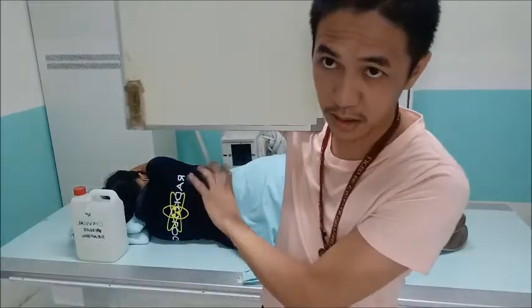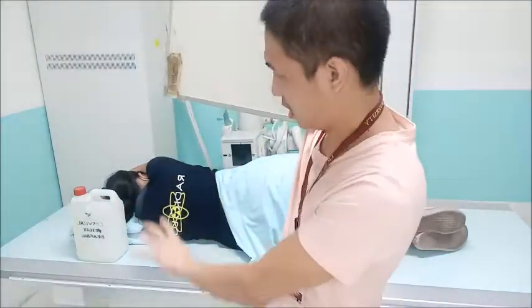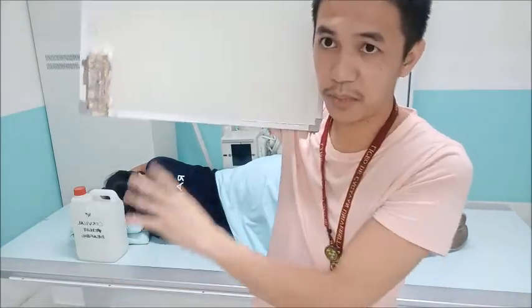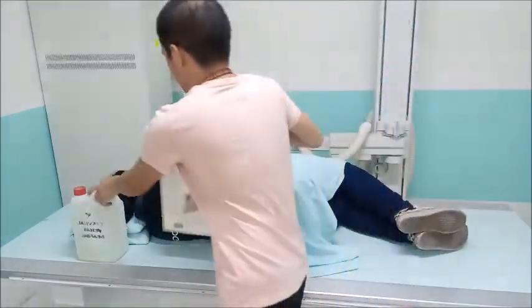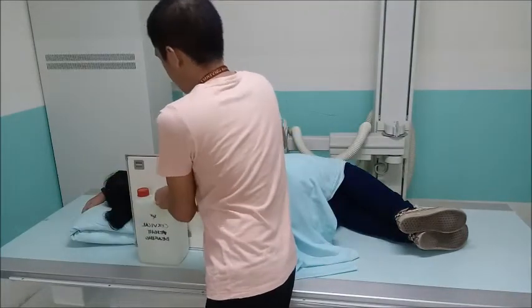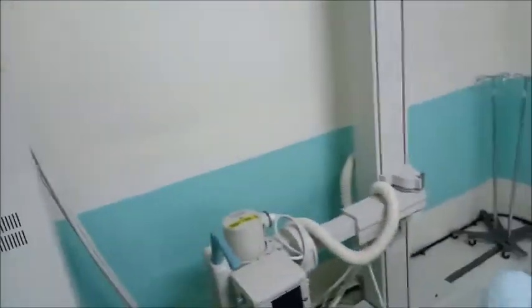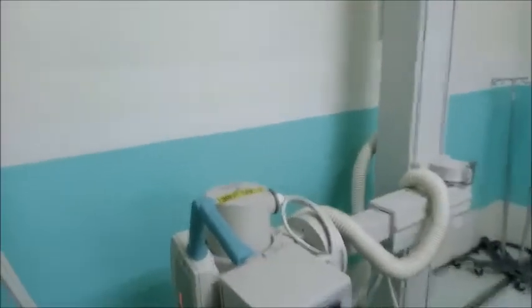That's why it is important that there's a foam wedge. If there's no foam wedge, then I can use a lot of books or maybe pillows. Okay, so for example, once the patient is elevated, then just simply adjust the X-ray tube.